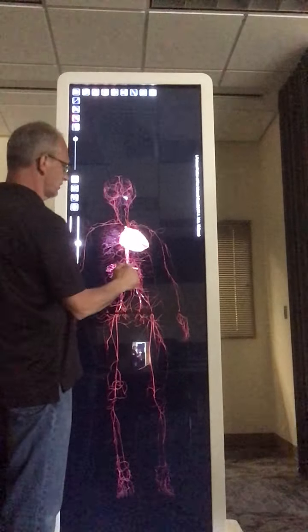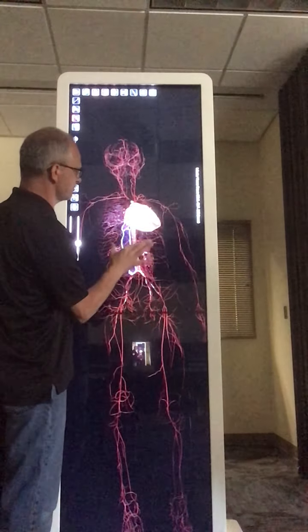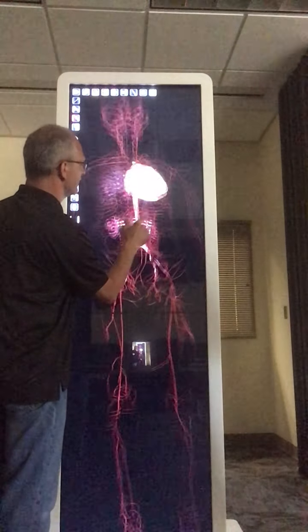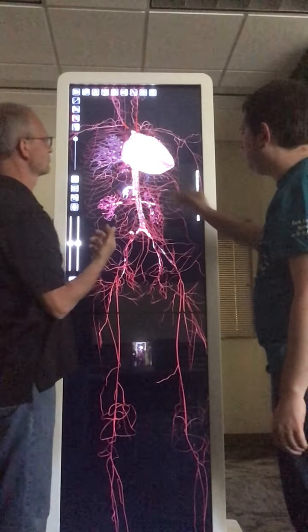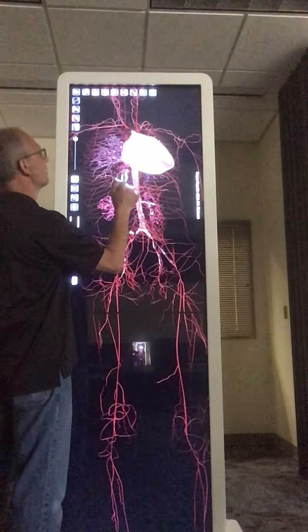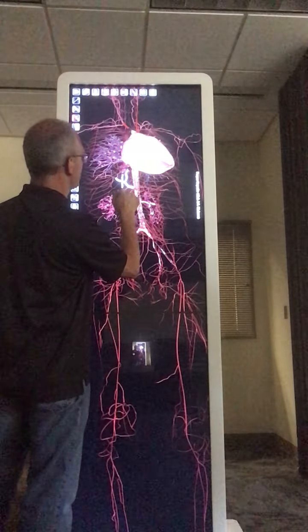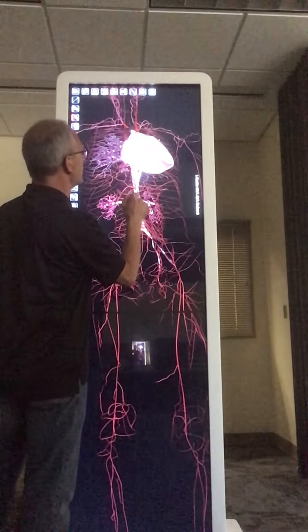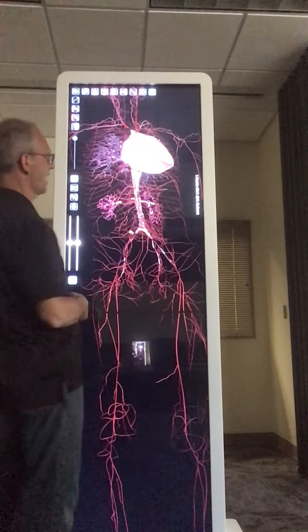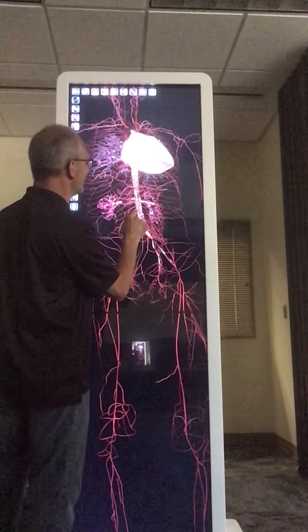So when you think about this, you think about branches here. If I can just isolate some of these branches off of the dorsal aorta, right? Now there's the dorsal aorta. I could just isolate that branch. Well, there's gastroduodenal. That means it's going to the duodenum, it's going to the stomach. Here's hepatic, going to the liver. And also cystic is going to branch off of that and go to the gallbladder. So if I come over here, here's a gastric. All of these are supplying the viscera of the abdomen. And if I can label that one down here, it's really not letting me do it.